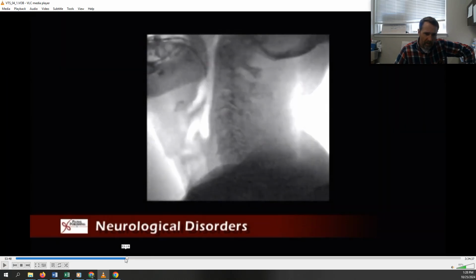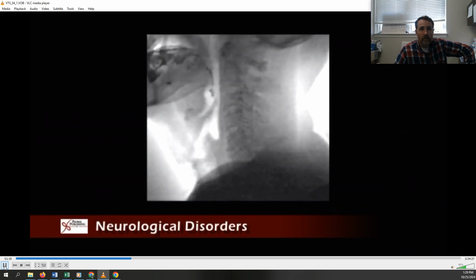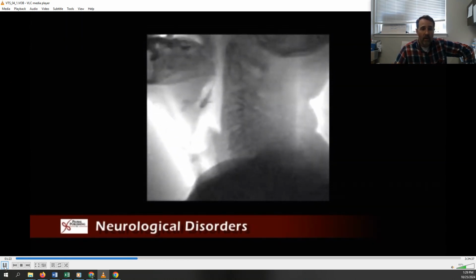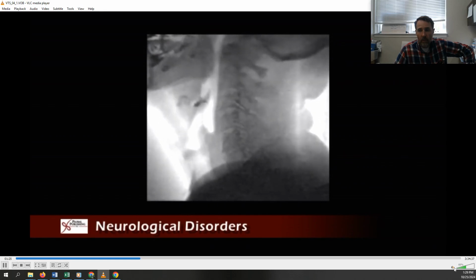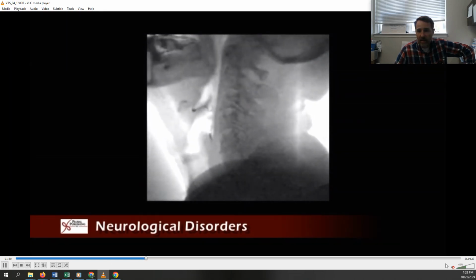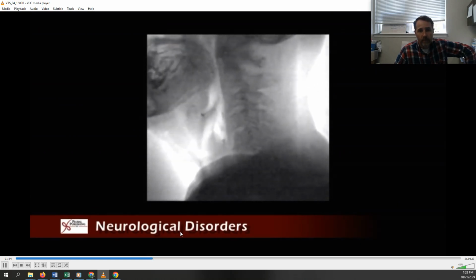So let's go back and see that delay. To move the material posteriorly. Anterior spillage of material is also evident. So we would already be counting when a very small percentage of the bolus reaches the pharynx, 4, 5. It's about a 5-second delay. Only a minimal amount of material enters the esophagus.